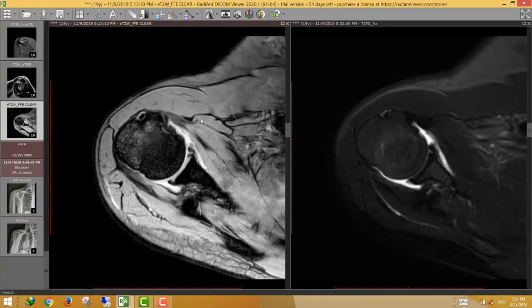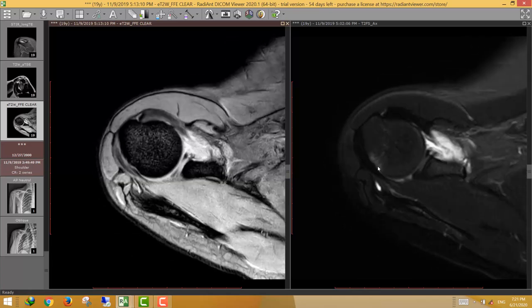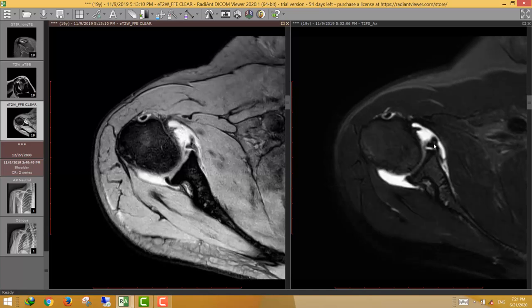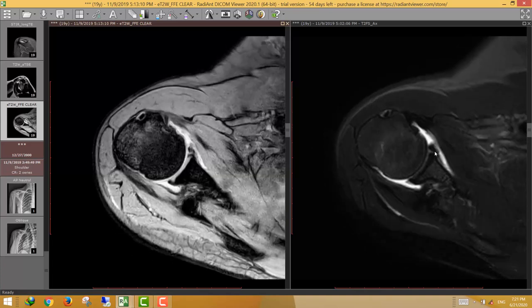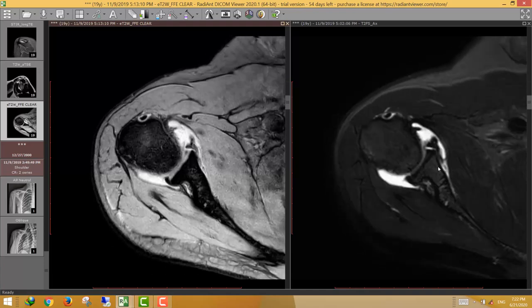The last case is another shoulder dislocation. We can see the characteristic posterolateral marrow contusion — Hill-Sachs injury — and avulsion of the anterior inferior glenoid labrum without affecting the underlying bony glenoid rim. There is no definite osseous fracture, but there is definite avulsion or separation of the anterior inferior glenoid labrum with fluid signal separating the labrum and also the periosteal attachment. The labrum is no longer attached to the glenoid directly or through the periosteum — this is a Bankart lesion (not a Perthes lesion).